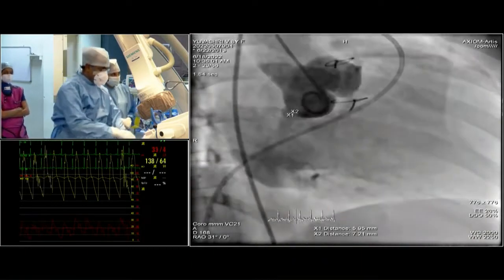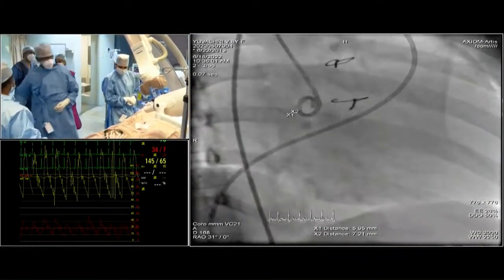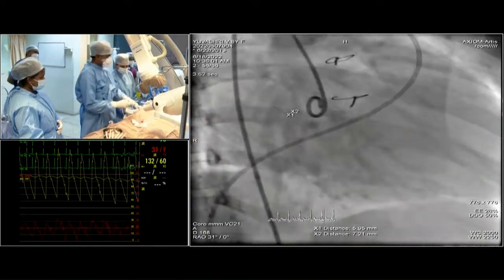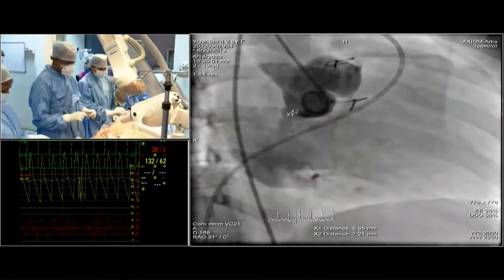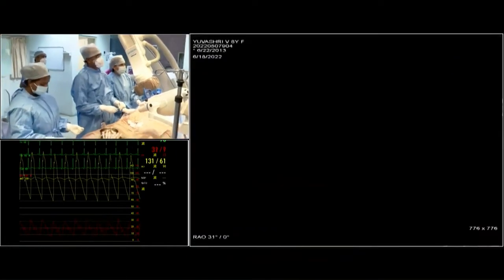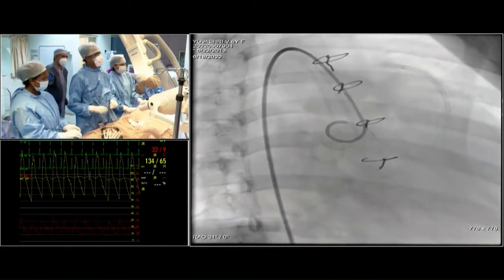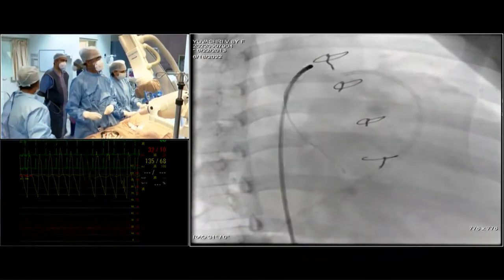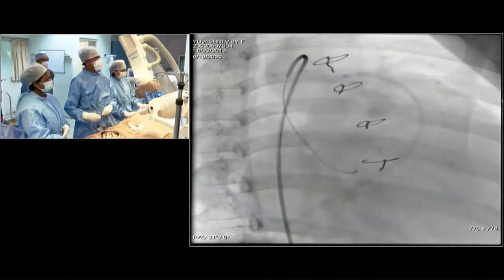Our plan is to go retrograde, snare it from the right atrium, put a long sheath, and close from both ends — closing both the aortic and RA side. That is an absolutely perfect method in this case. Unless the patient is very sick requiring rapid retrograde closure using a muscular device, this approach is ideal. Professor Jai Ranganath has great experience and can offer a comment.